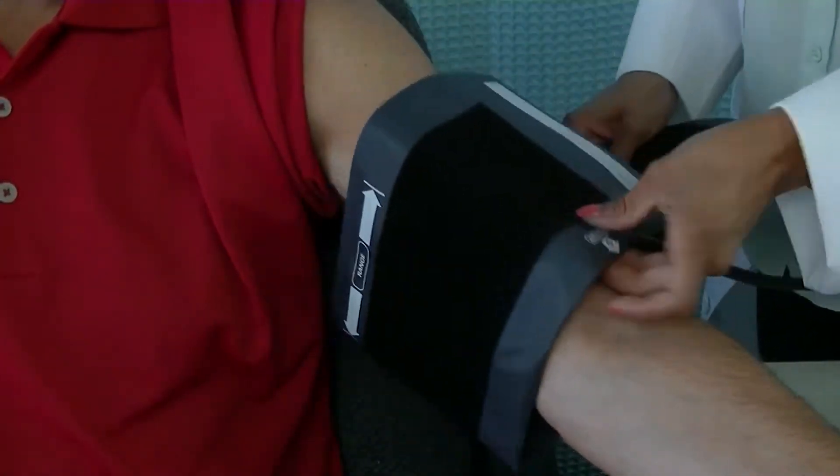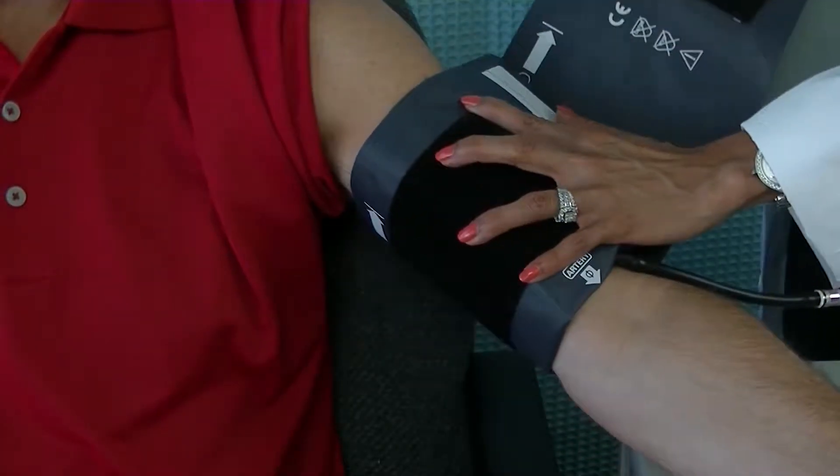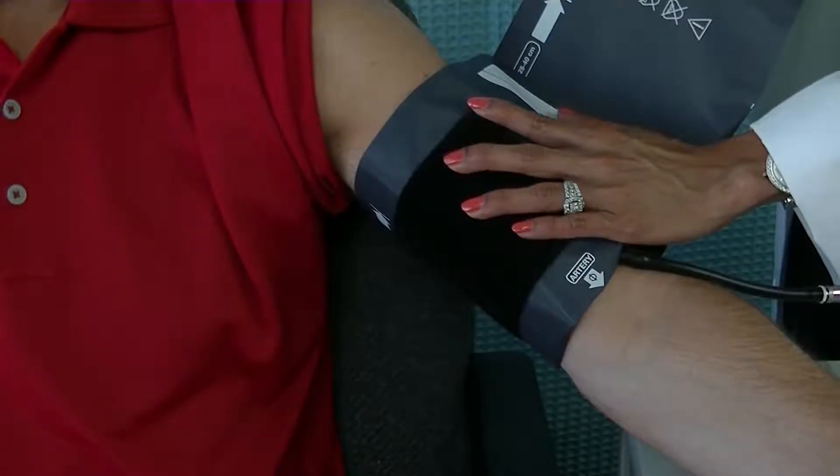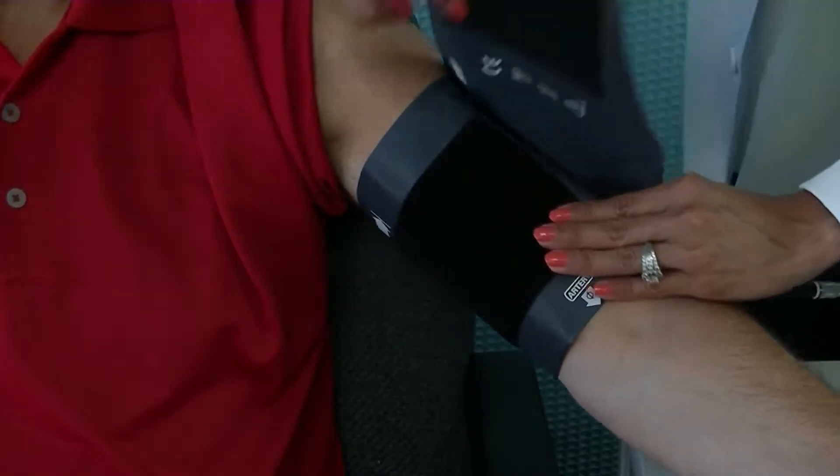Prepare the patient by applying the cuff to the arm. The index line should fall within the printed range markers. If not, select a larger or smaller cuff to ensure an accurate reading. Make sure the arm is relaxed and supported, and ask the patient to stay still and quiet.